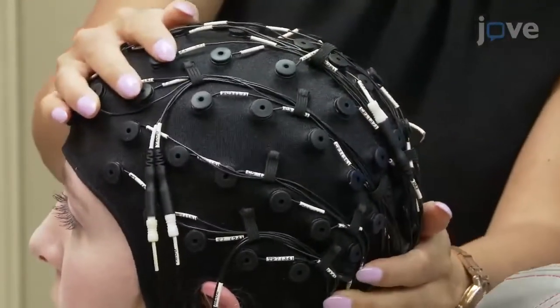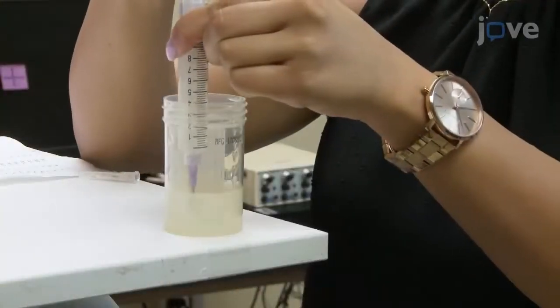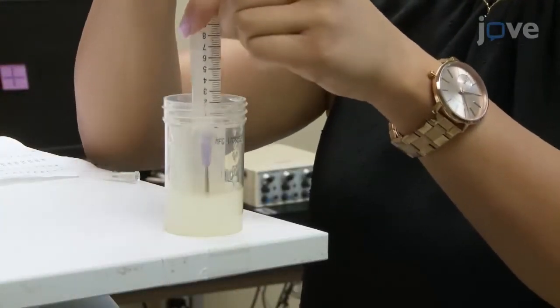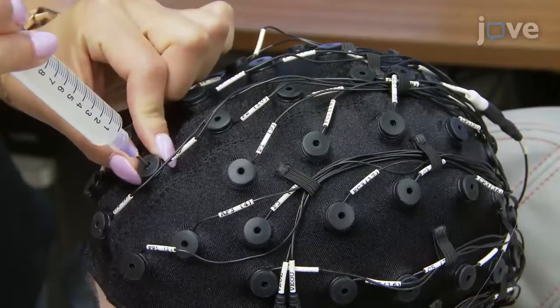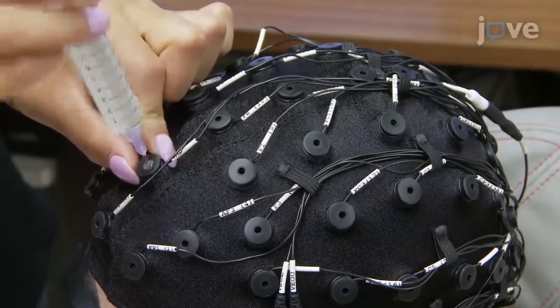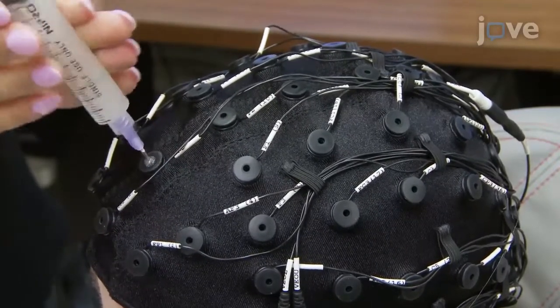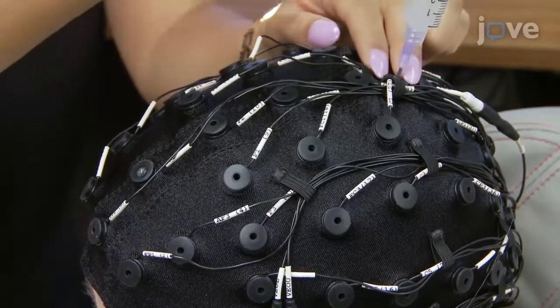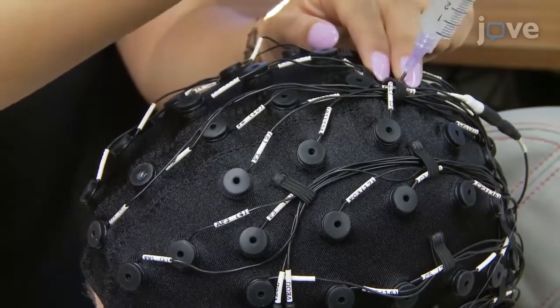Ensure that all electrodes are tightly touching the scalp and are functioning. Next, adjust the blunt tip of a syringe and fill it with electroconductive gel. Place the tip inside the electrode hole and then lightly press the plunger until there is some paste on the skin. Then scrub the scalp with the blunt tip and ensure that paste does not spill out over the top to avoid bridging.